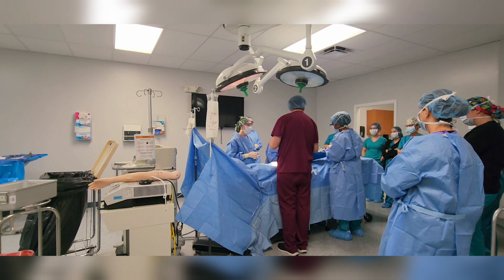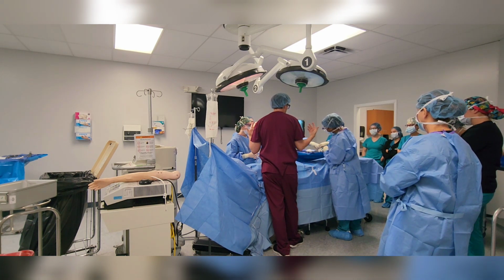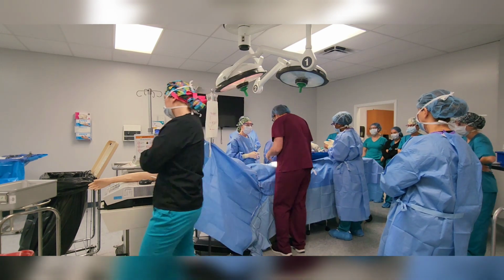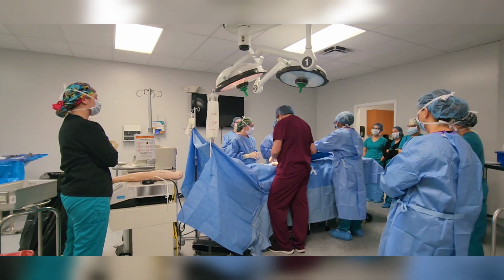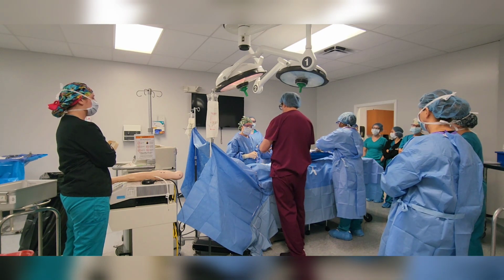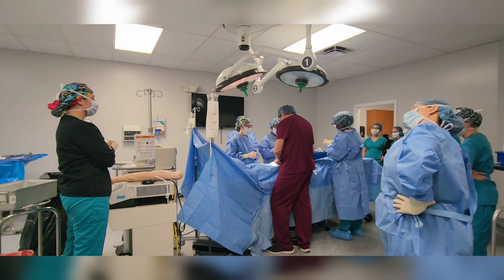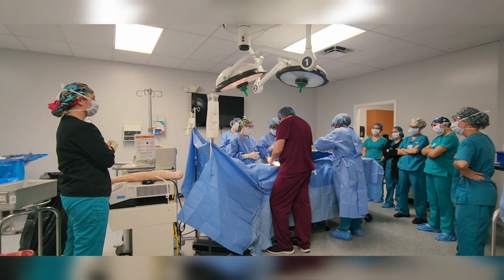Hemostat. So again, Kelly, hemostat. They call a lot of things out in the world, right? Just verify. Coming your way, doctor. So he knows that you're there, because he's looking down. Hemostat is just quiet all of a sudden. So dangle. Make sure it's clamped. Hold your hand out. Kind of feel it there, right? All right, I need to work on that a little bit. Hold that real quick. Coker.